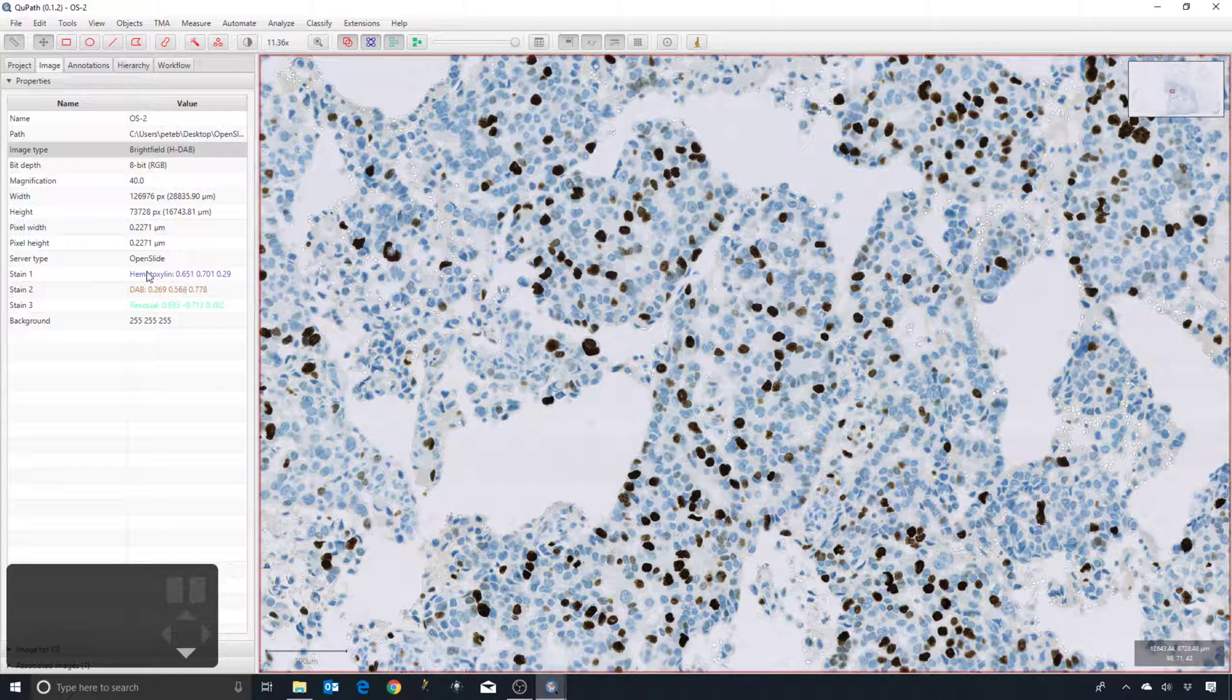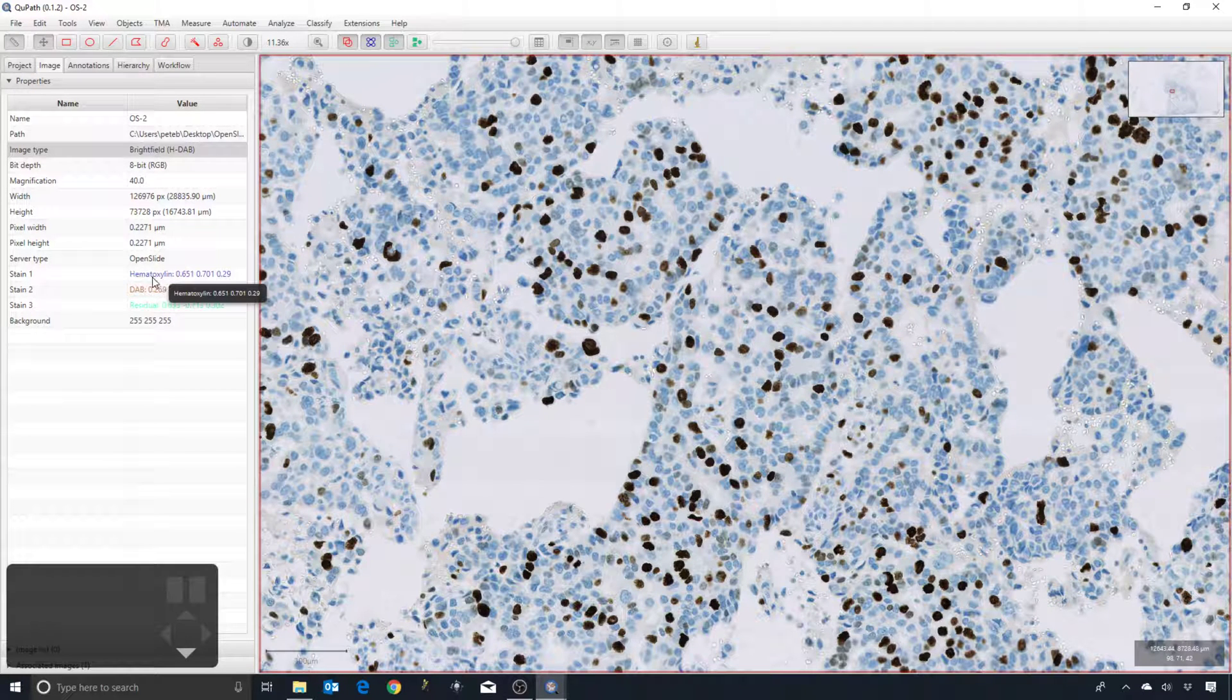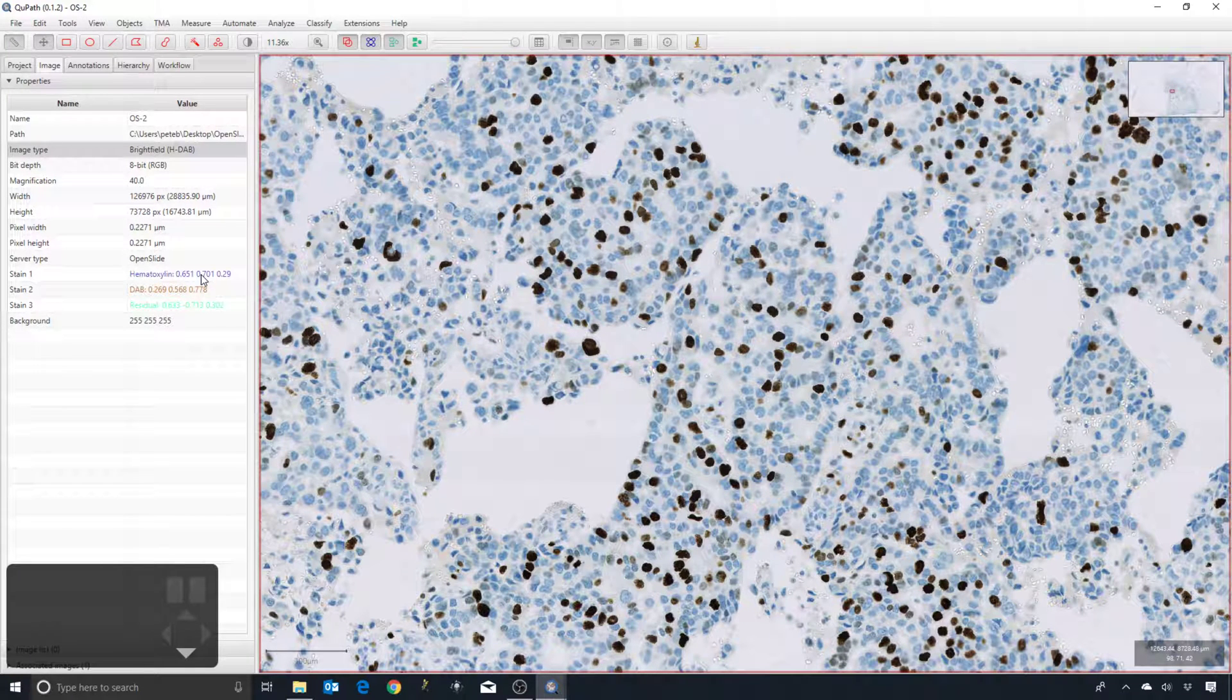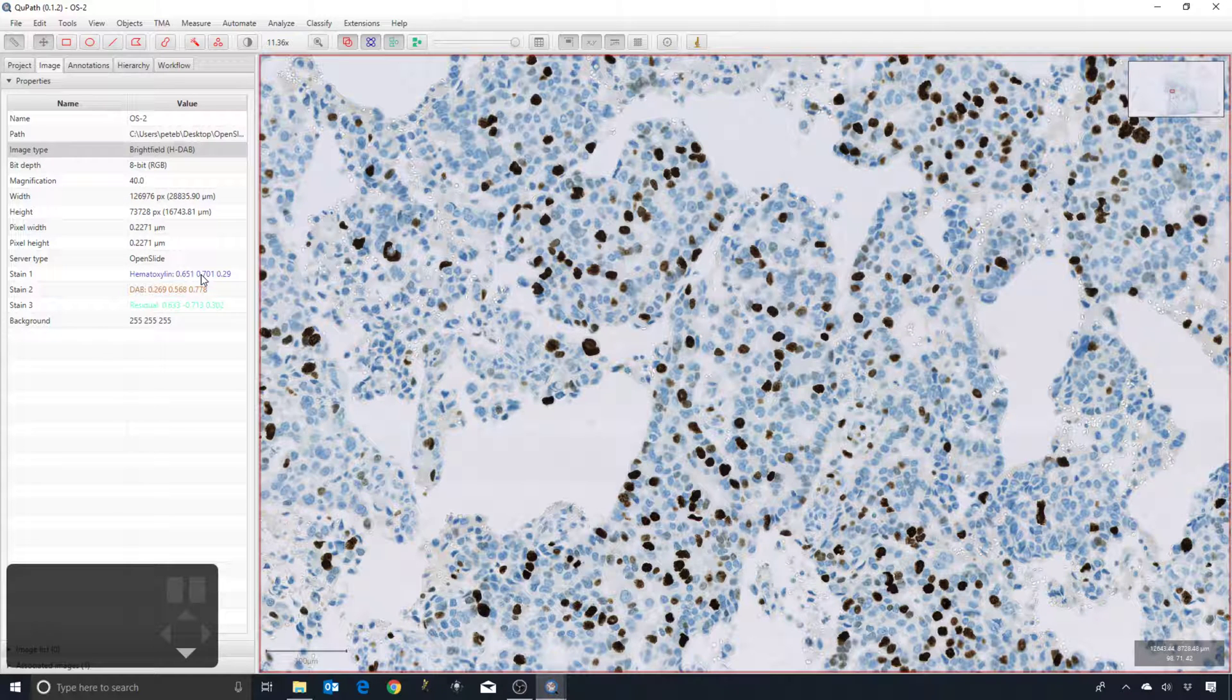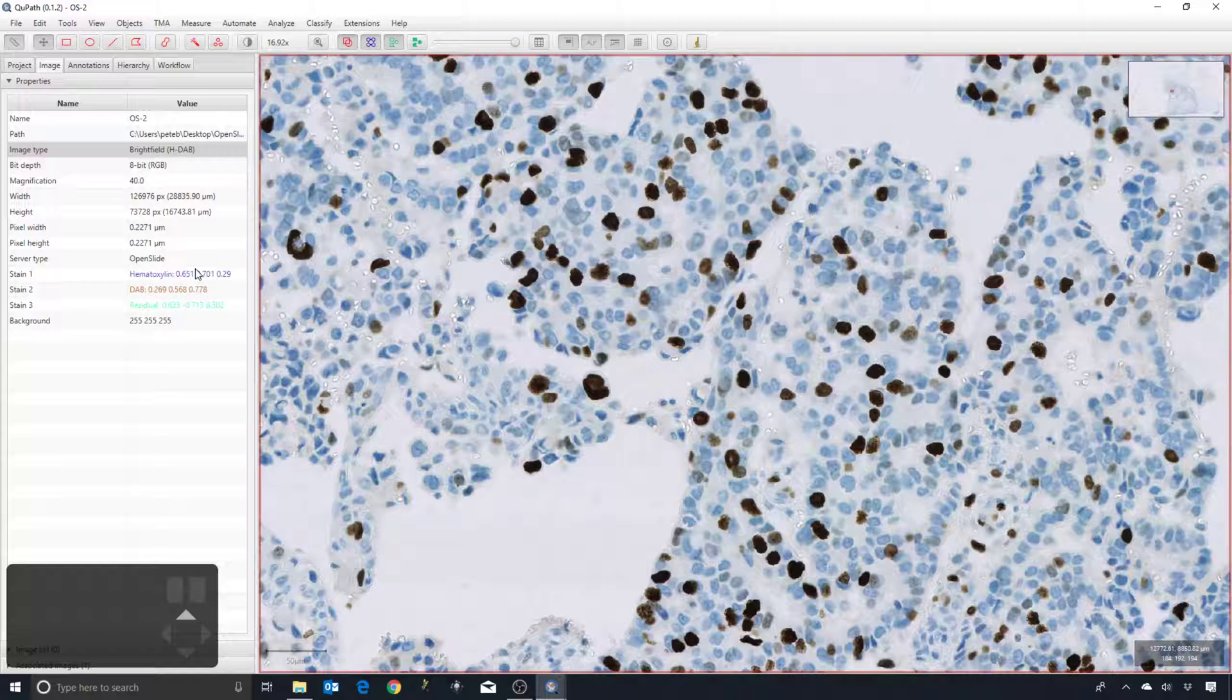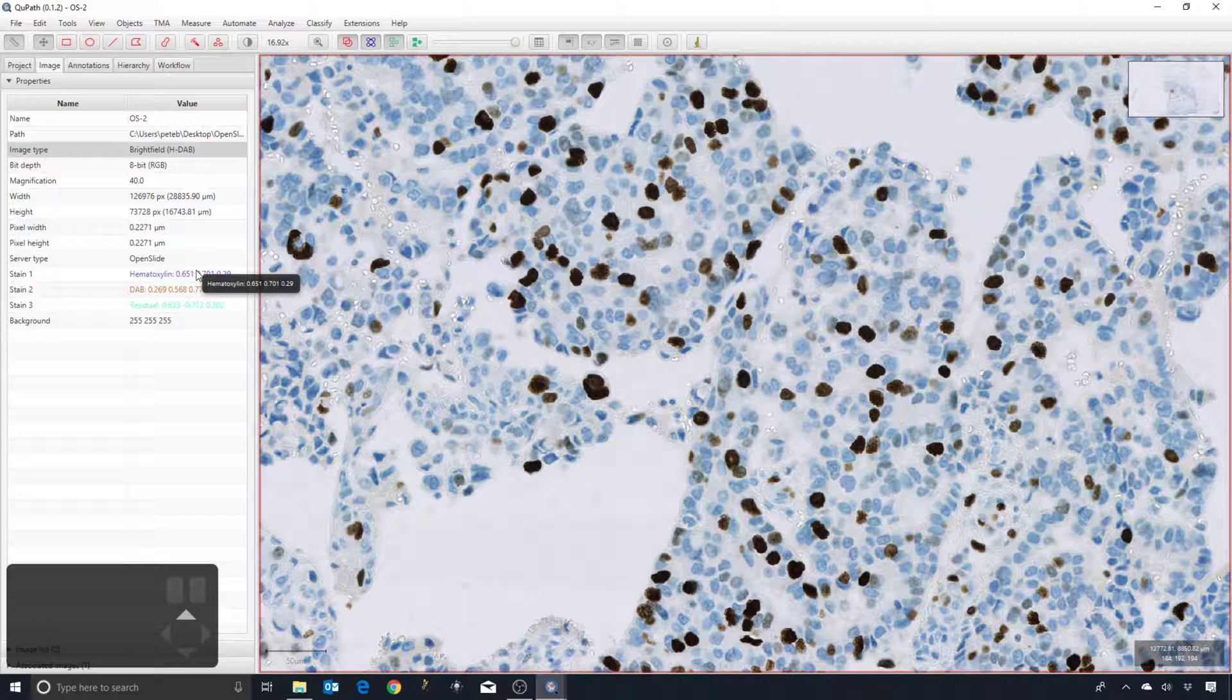But the stain vectors then that it uses are simply defaults. These stain vectors are essentially characterizations of what color blue the hematoxylin is and what color brown the DAB is. Because those are simply defaults, there's no reason to believe that they're necessarily going to be appropriate for your images or indeed for this image.